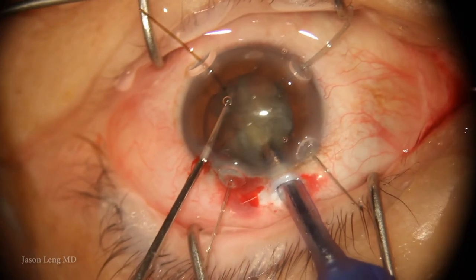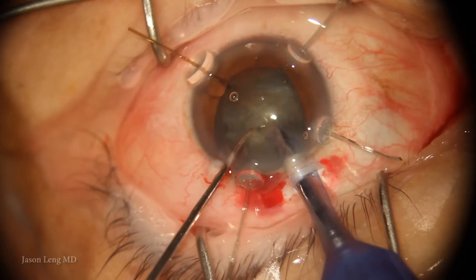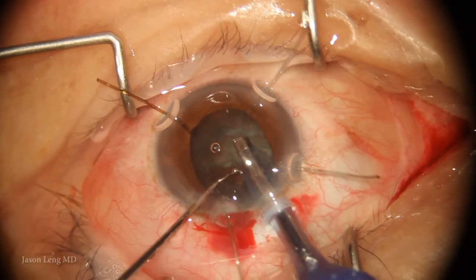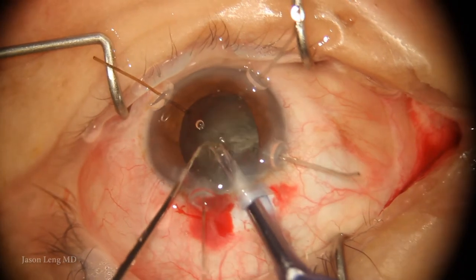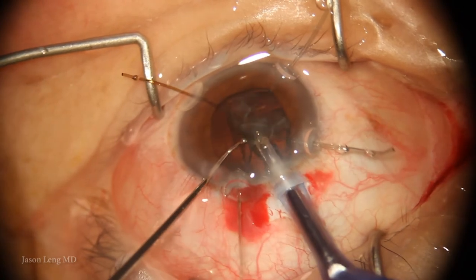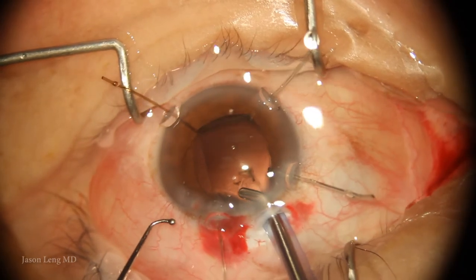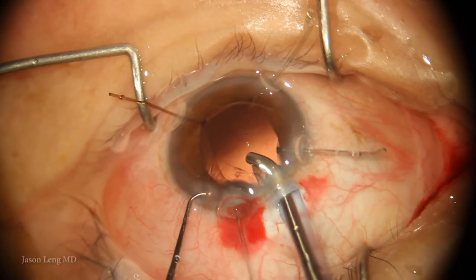Here I'm doing my horizontal chop, proceeding very slowly so I don't stress the zonules and can keep an eye on the bag. I'm assuming the bag could possibly billow up from below, or the equator might be coming in where I'm not adequately visualizing. As I'm removing the last pieces in phaco, I can see the equators of the bag are coming in on all four sides.